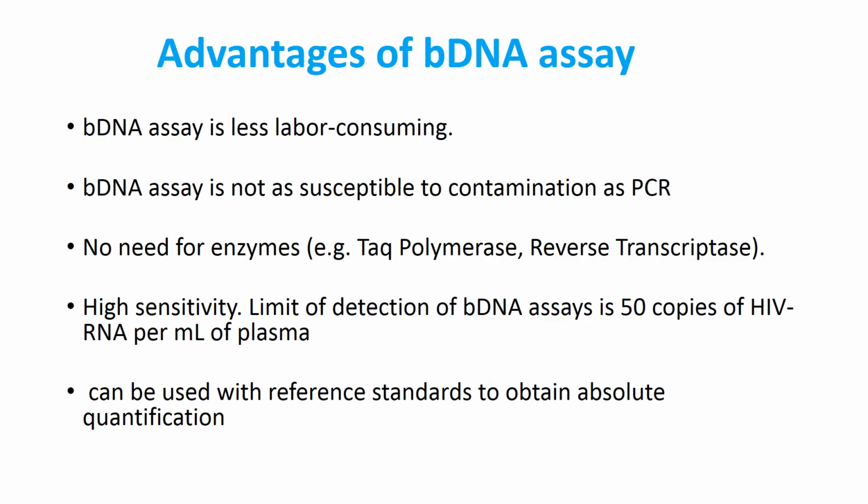Branched DNA assay has several advantages. The first advantage is this assay is less labor-consuming because it has a simple sample preparation and no amplification step. It's also highly amenable to total automation.